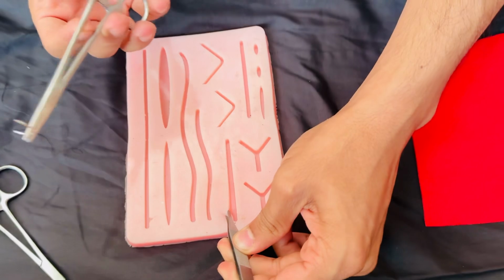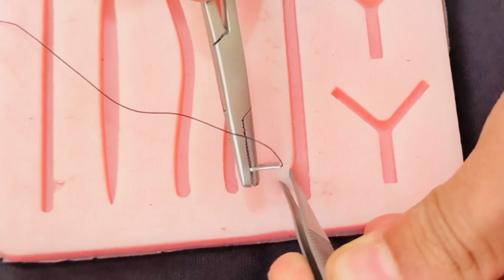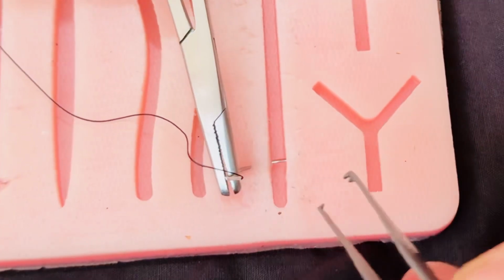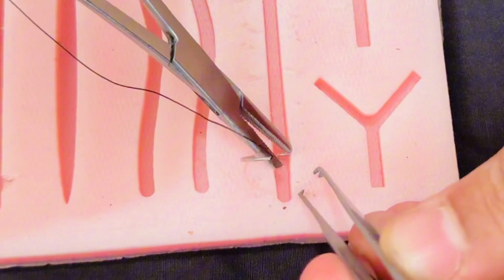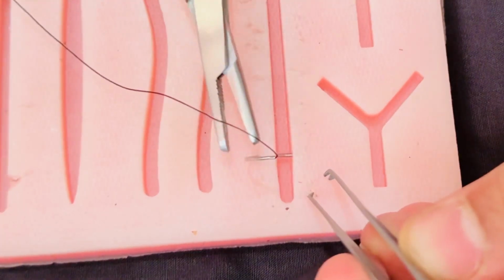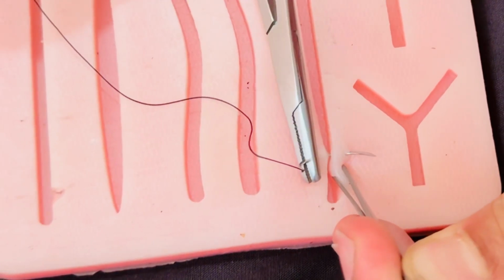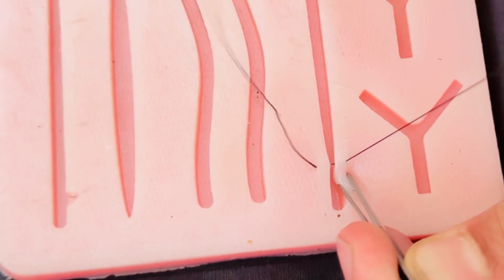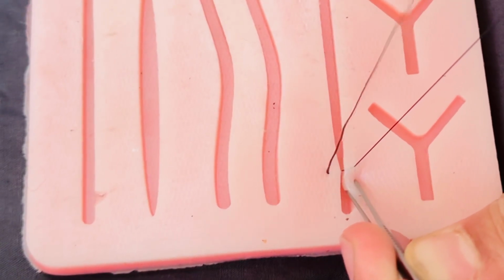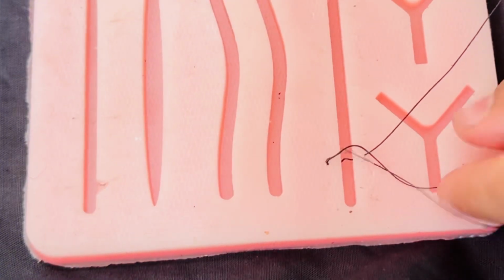But with the help of tissue holding forceps, just have a look into the wound and its depth. So pass or insert the needle from one side and take it out from the other side like this. Take out all the thread except the final 1/3 of the thread, in order to make a loop and to give a surgical knot.